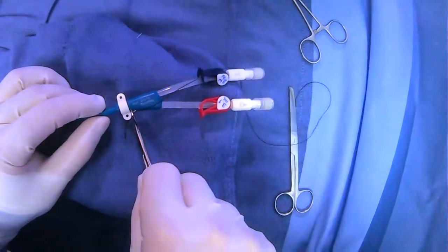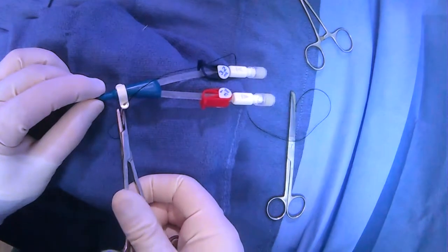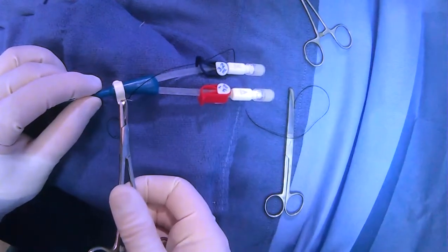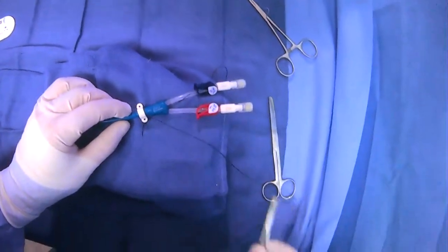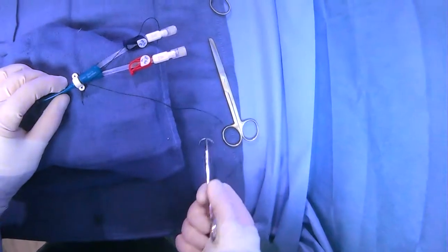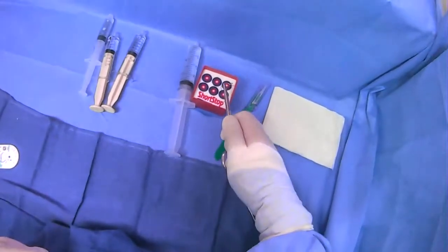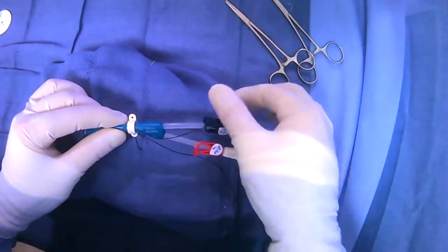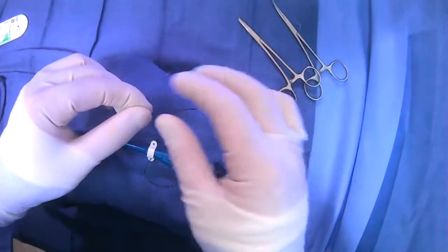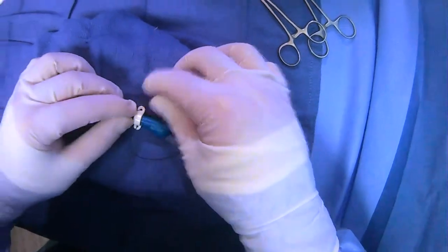Then what you can do is feed your needle through one of these side holes here. You can cut your needle off and just bury it. So you have one suture coming in through one side hole, and then you just take the other one and feed it through the other side.